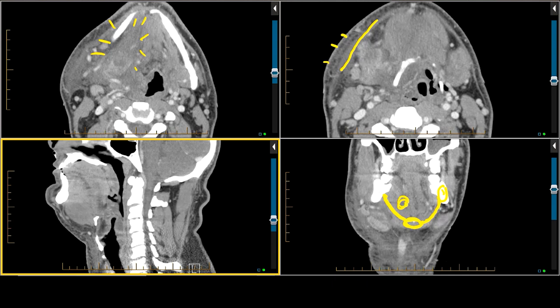If we have a large infection involving the floor of the mouth, this can result in elevation of the tongue base. The airway is behind the tongue base, and this narrows the airway. The infection can extend down inferiorly to involve the preepiglottic space and the epiglottis. This is diffuse edema involving the epiglottis, and we can see it's narrowing the airway.